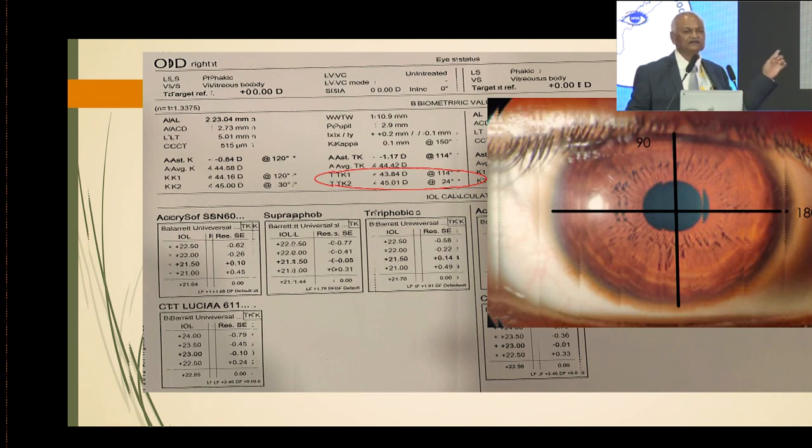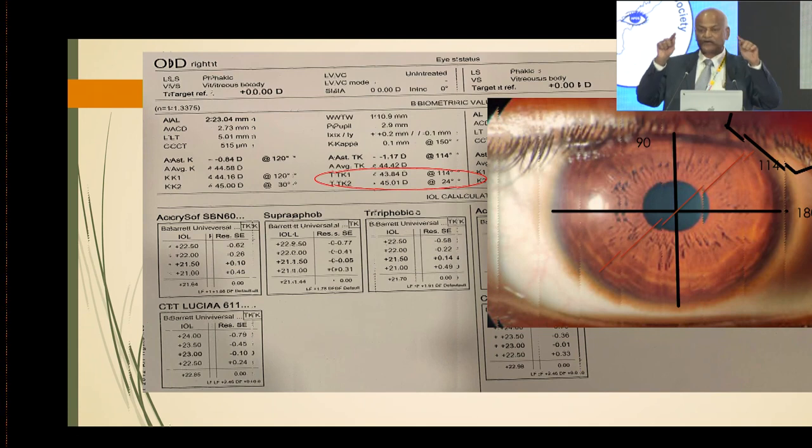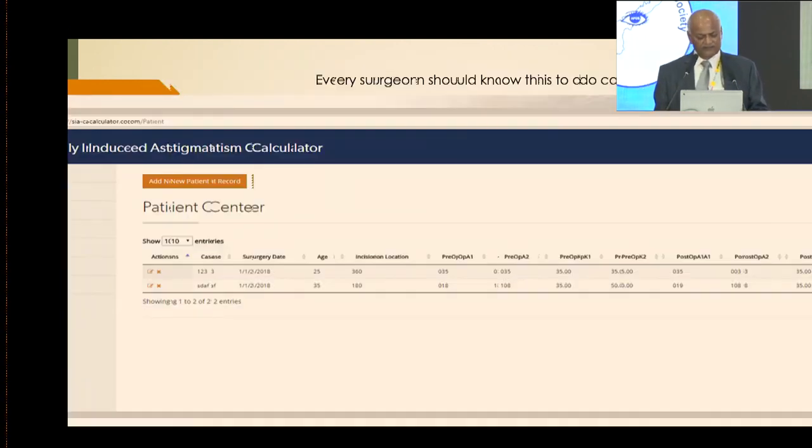Now, see here, you have seen the astigmatism, and here what I am doing is I am going in the quadrant where I can correct the astigmatism which is there, which is not possible in phaco, because in phaco our incision is 2.2 millimeter or 2.8 millimeter. Here our incision is 5.5 millimeter or 5 millimeter, and that will correct the astigmatism without any other thing. So, before, if you know the astigmatism, accordingly you can take the incision and then reduce the astigmatism. This is what you can see when you calculate pre-op; pre-op only you can decide how to go ahead and how to reduce the astigmatism.